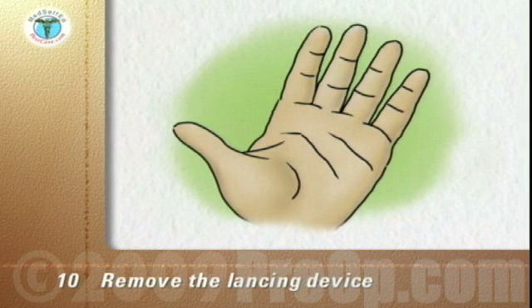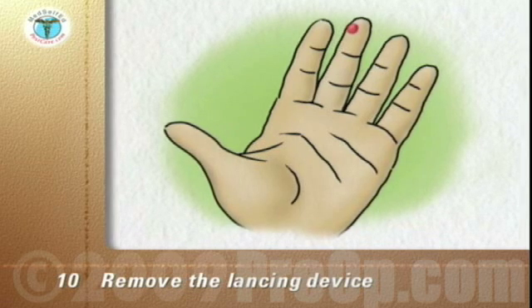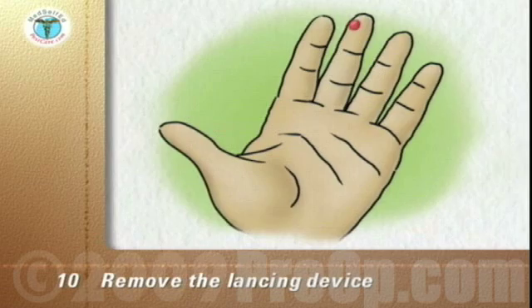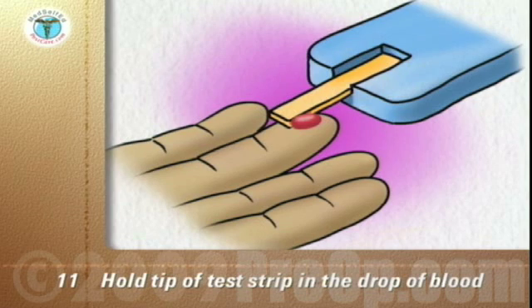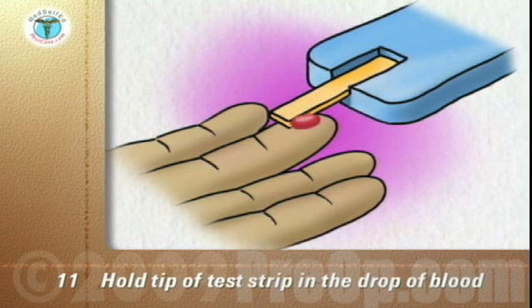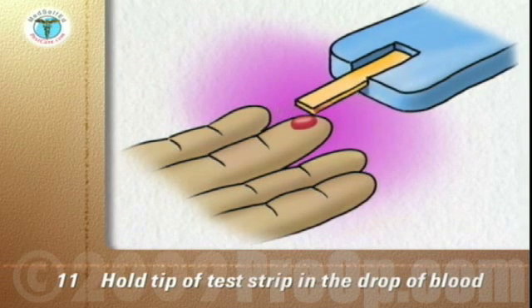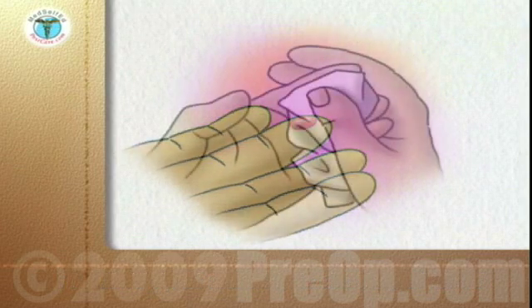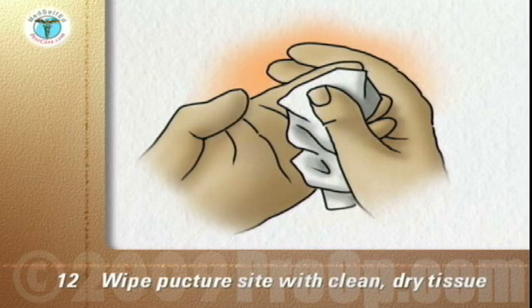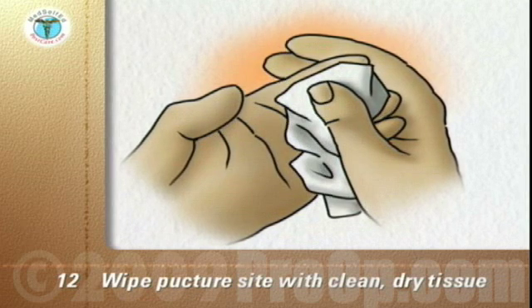If a drop of blood does not form on its own, stroke down the finger towards the puncture site without going as far as the site itself. Hold the tip of the test strip in the drop of blood until the meter tells you the test strip is filled, usually by beeping. Remove the test strip from the blood. Put the device and the strip aside until the reading is complete. Wipe the puncture site with a clean, dry facial tissue and use the tissue to hold pressure on the puncture site until the bleeding stops.